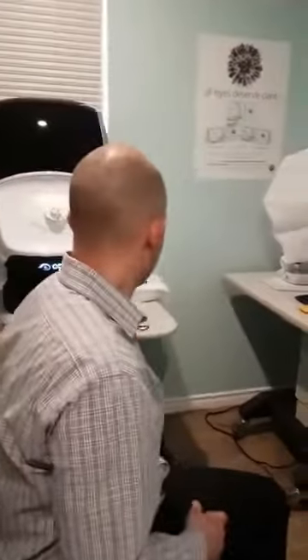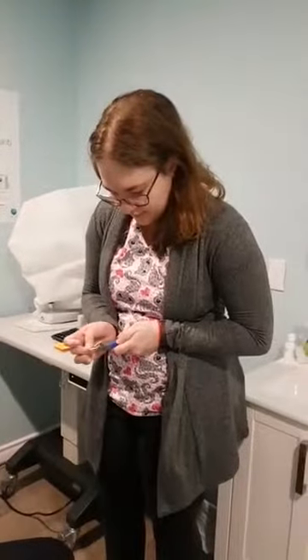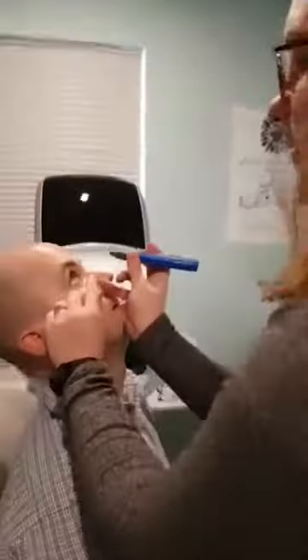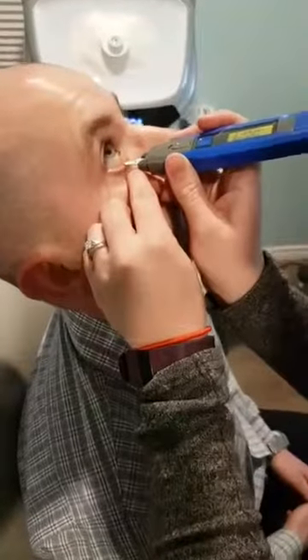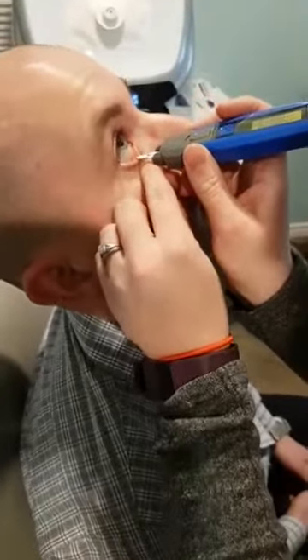I'll be the guinea pig today and Steph will help us out. Tilt back, you're going way up. All we do is pull the eyelid down a little, rest the tab on the eyelid, wait for it to beep, and we get a reading. Perfect, and that's all there is to it.